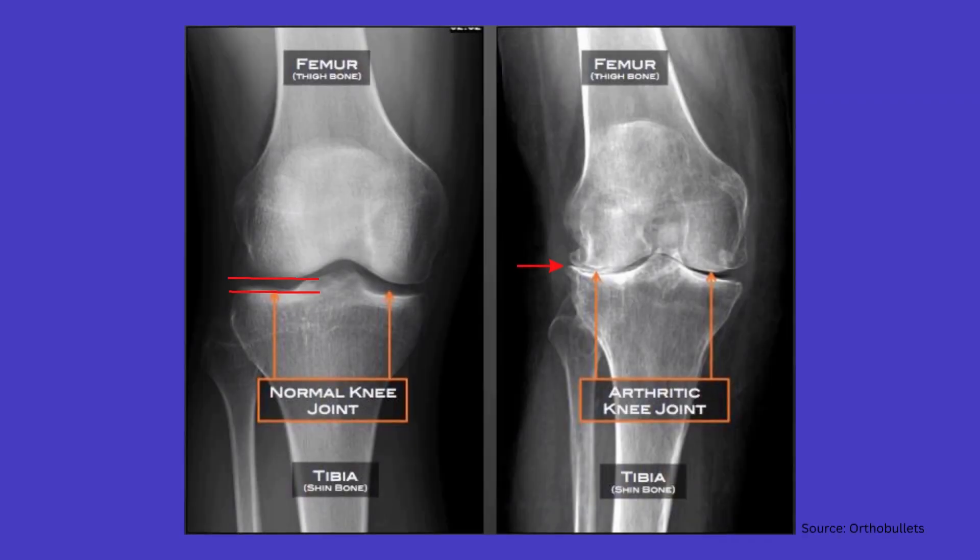Looking at this image as an example, you can see here compared to the normal joint how the joint space is narrowed. This is typically due to loss of articular cartilage, thus lessening the cushion between the bones of the joint.